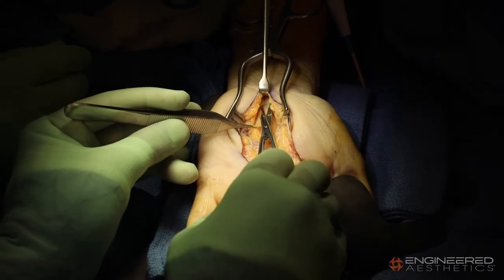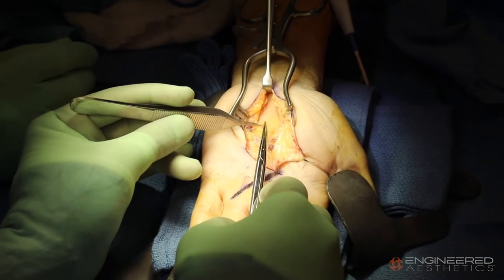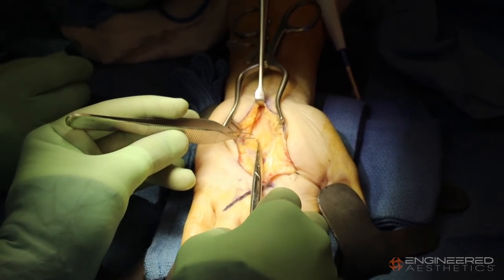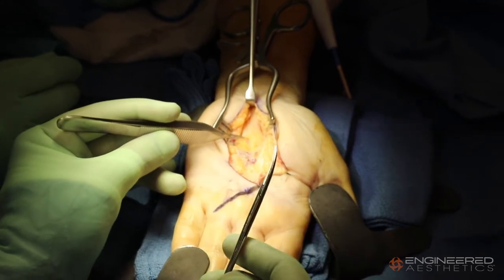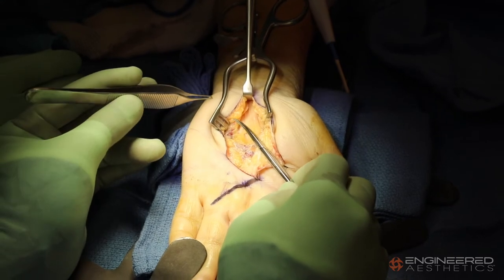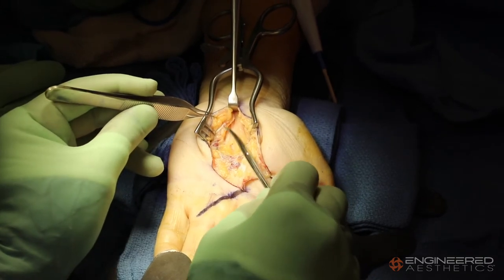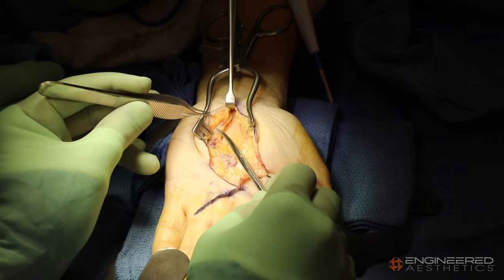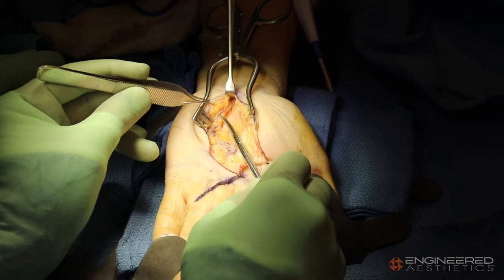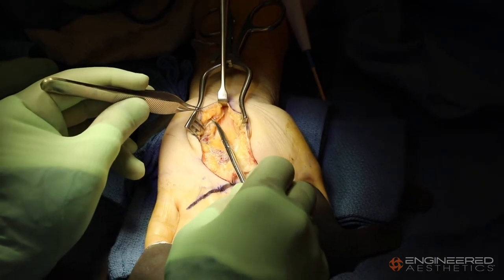This is called an epineurectomy. I'm removing the scarred epineurium, and I will also protect the nerve with a nerve protector that helps separate it from the surrounding soft tissue and prevents the development of more scar tissue that might result in recurrence of her symptoms. The ulnar nerve is on the other side of this tissue. I'll be opening up the common side wall that exists between the carpal tunnel and Guyon's Canal. This is the transverse carpal ligament, which makes up the roof of the carpal tunnel but also the floor of Guyon's Canal. As we dissect ulnarly, we'll be able to expose the ulnar nerve.